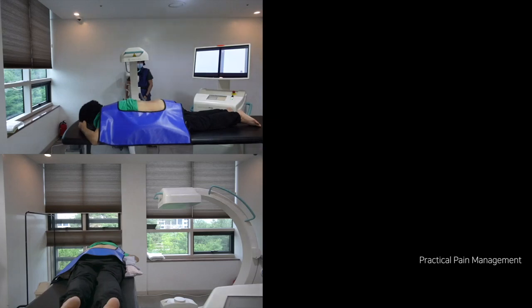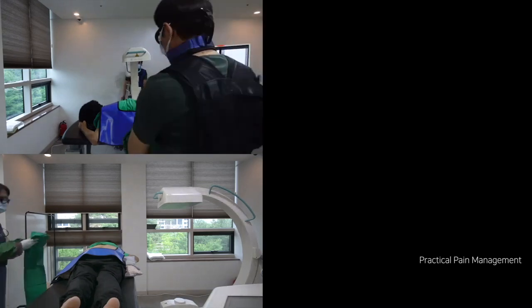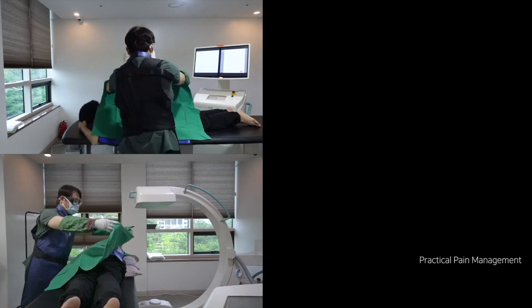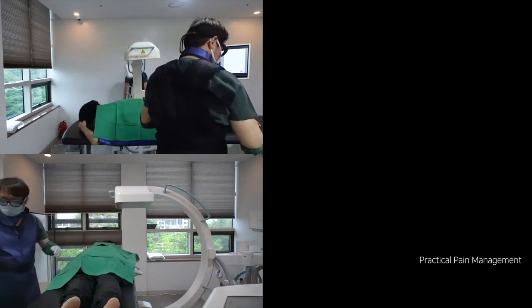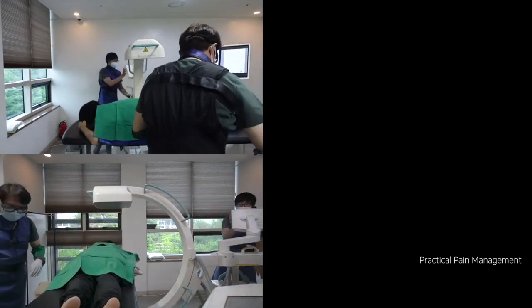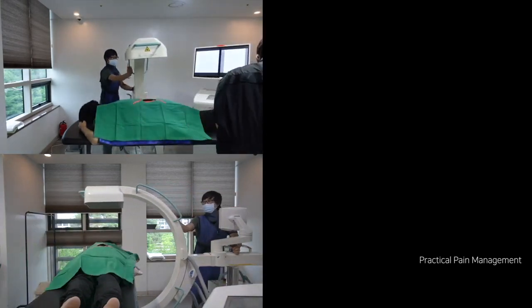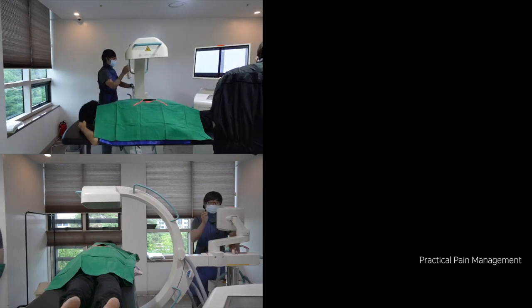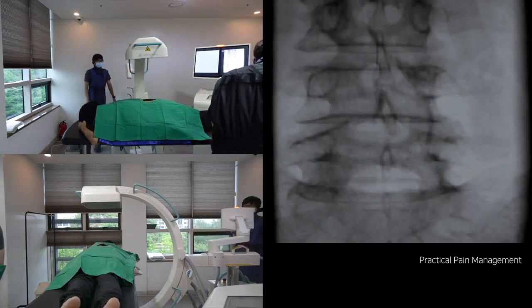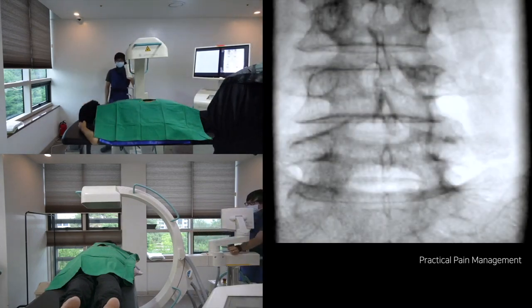Welcome back. I am Dr. Lee of Practical Pain Management. This is one of the videos that shows how much rotation and tilting I need to find a target and approach the needle. In this case, you will learn how to make a parisagittal interlaminar epidural injection under the contralateral oblique image guidance.